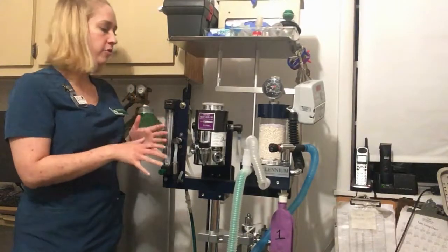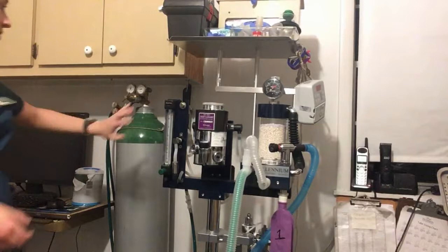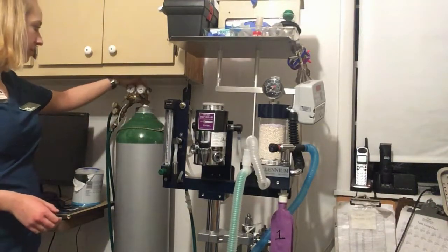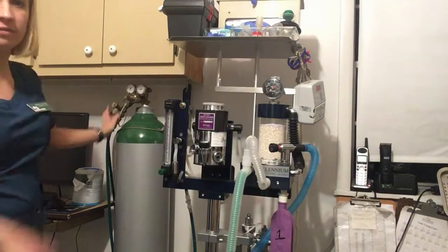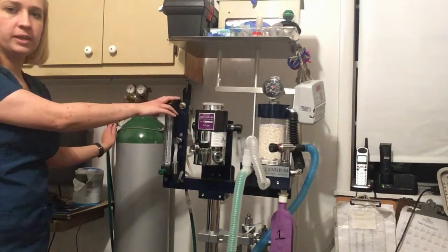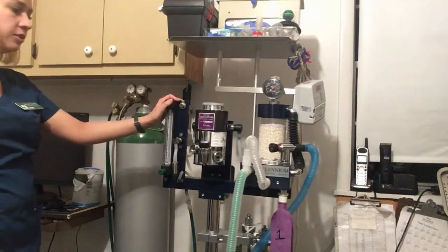Alright, so I'm going to be going over our anesthesia machine. First of all, this is our oxygen tank that we have hooked up to our machine. Right here you'll have the pressure gauges, and then we have two different lines going off of it, one for our dental machine and this one for our one in here. So this line does connect over here to our oxygen.